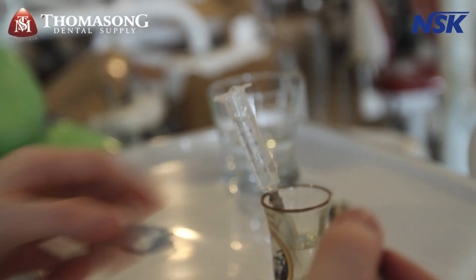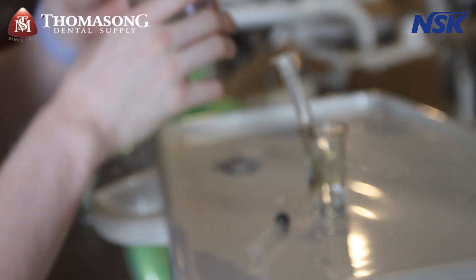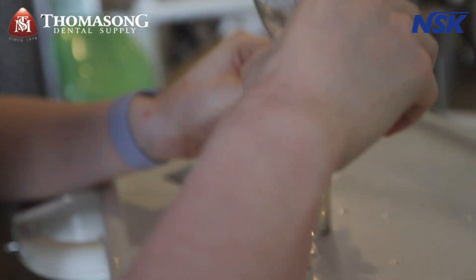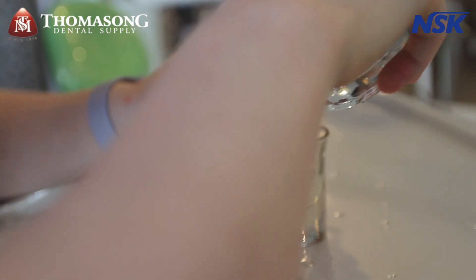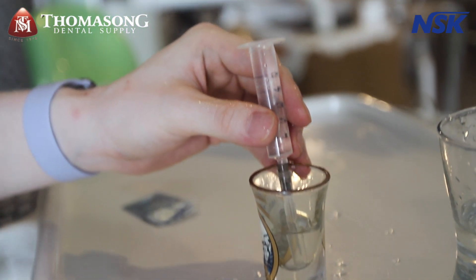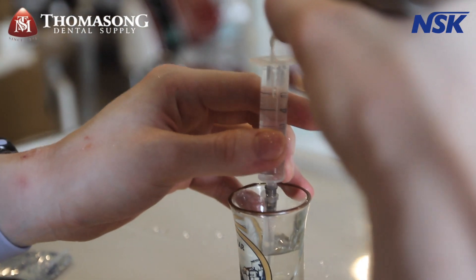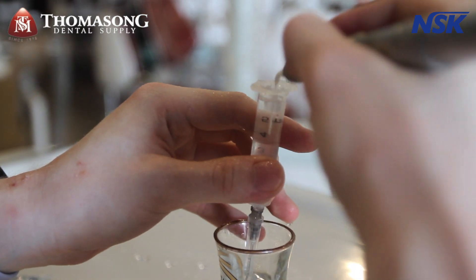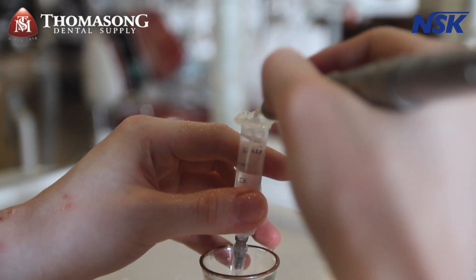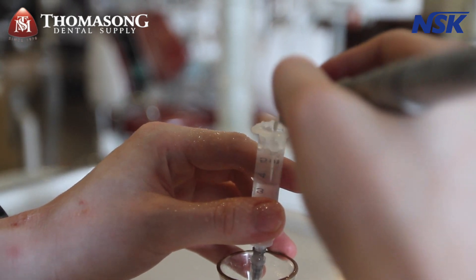Let me demonstrate that once more — fill the water a bit. Oh sorry, overflow! Maximum setting again. See all the bubbles — that's how powerful the Eddy really is.